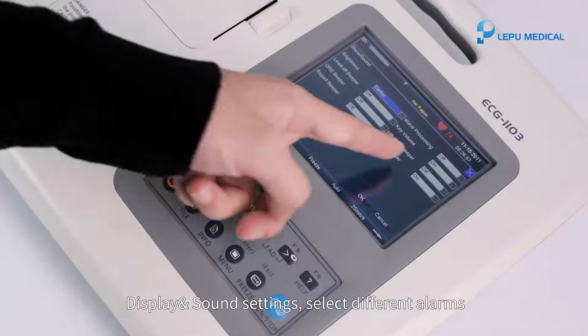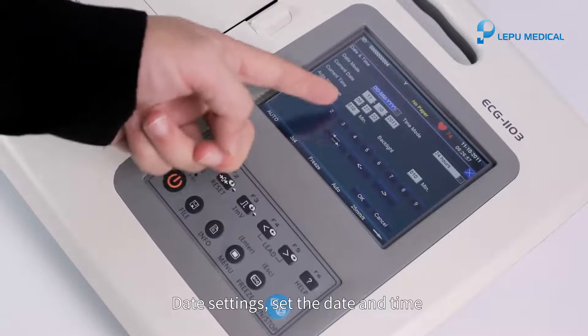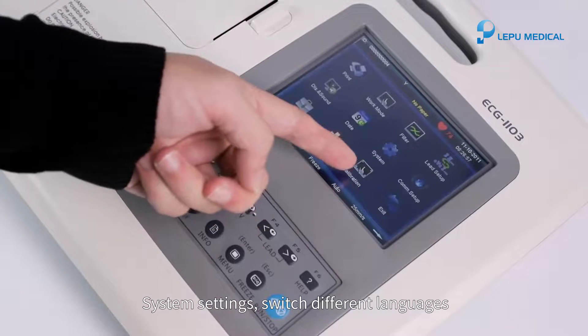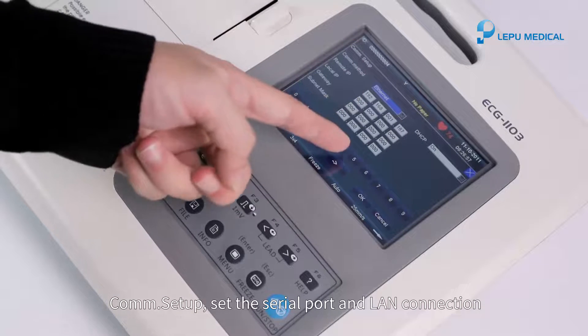Display and sound settings: select different alarms. Date settings: set the date and time. System settings: switch different languages. Comm setup: set the serial port and LAN connection.